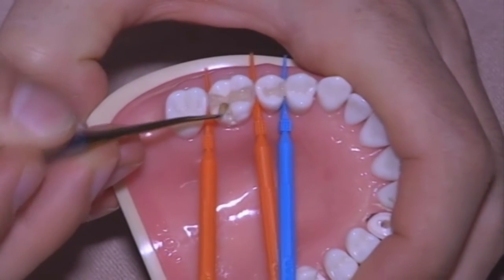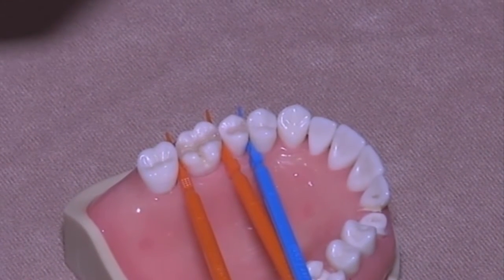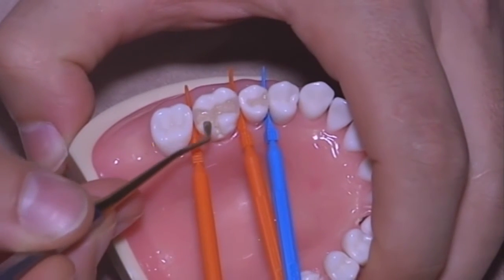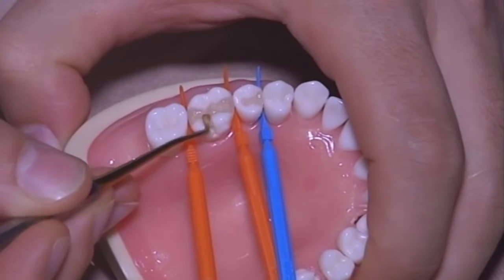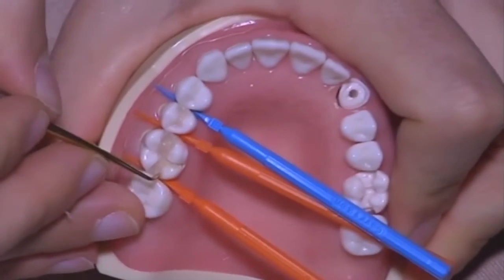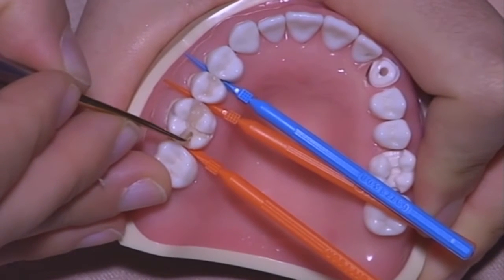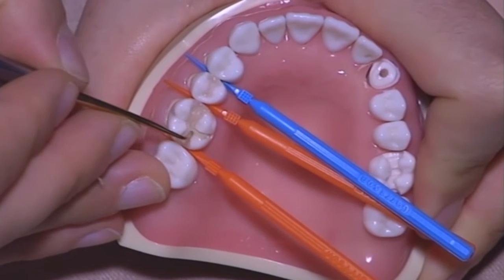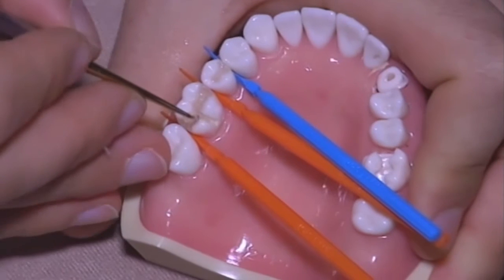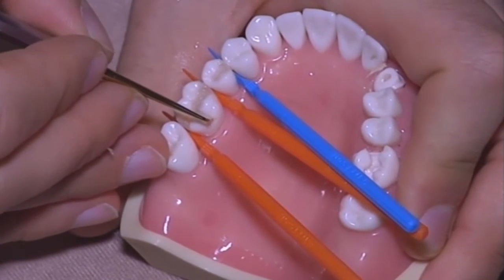Again, first pushing down the composite in order to close all the cavity. Secondly, distribute it in order to leave a space for the enamel, which is going to arrive in a while.